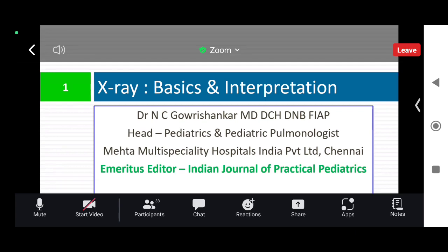Okay, we will start with X-ray. Majority will be X-ray. Few will be CT. Probably only one will be an MRI. Okay, I will start now.